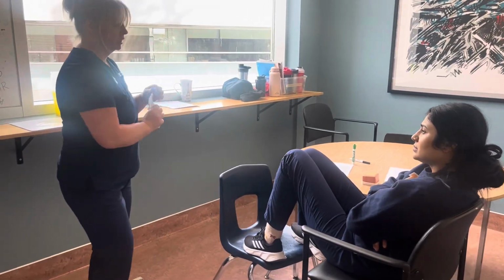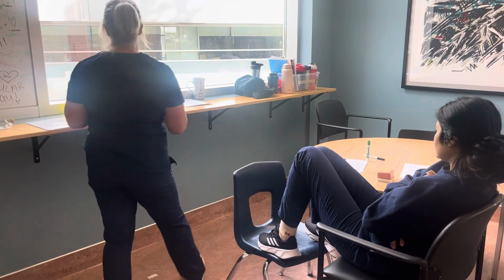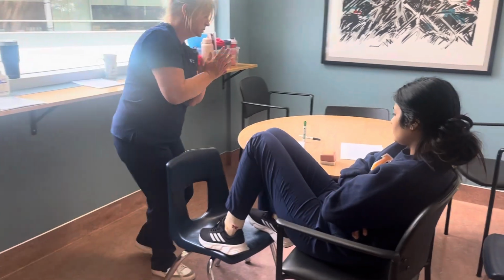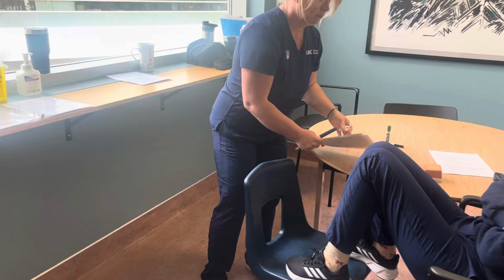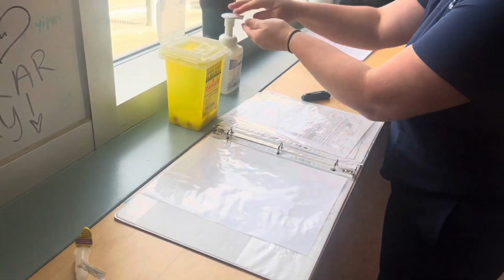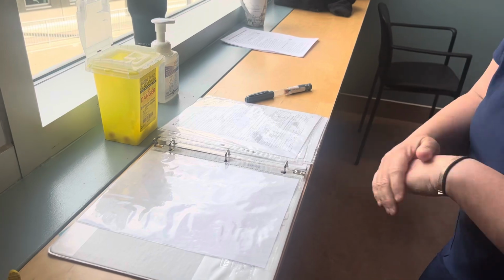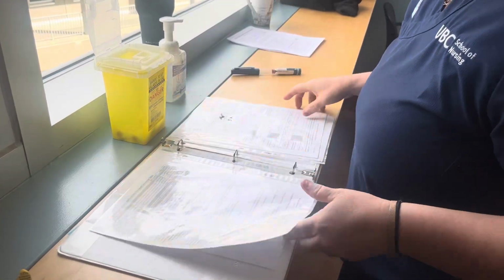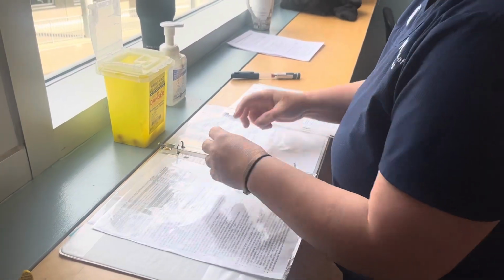Okay, so I'm going to take my gloves off. Hand hygiene. Leave the room. Probably do some more hand hygiene when I leave the room. So then we will come back to the MAR and document this.